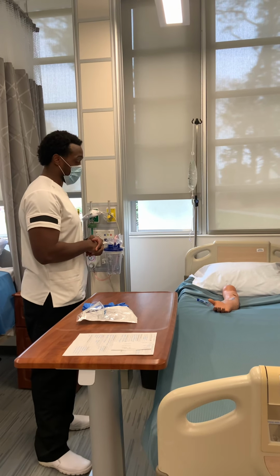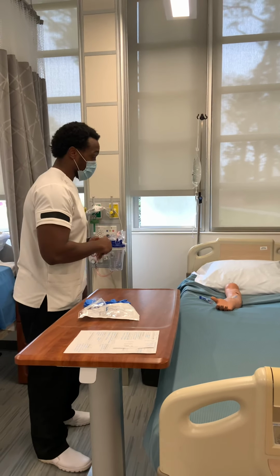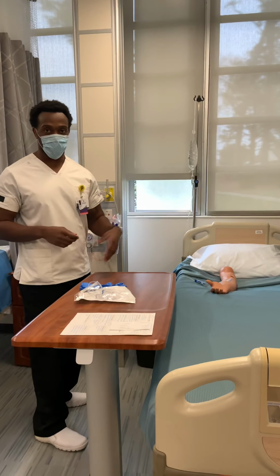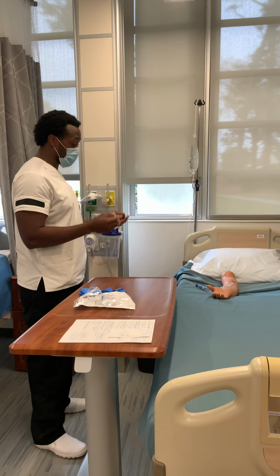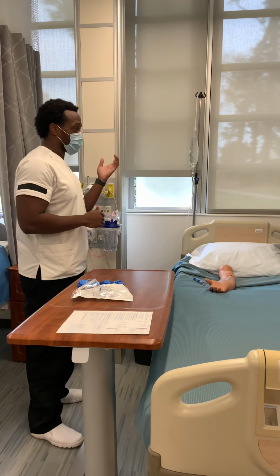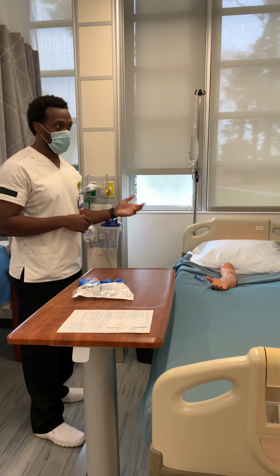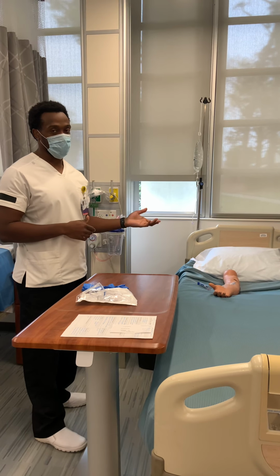Do you have any current allergies? Patient doesn't have any allergies. I will educate the patient about the drug. Vancomycin is an antibiotic. It changes the permeability of the bacterial membrane, which eventually causes cell lysis and cell wall death.